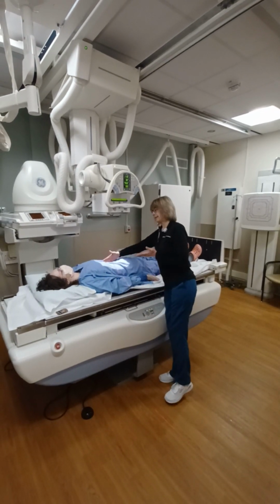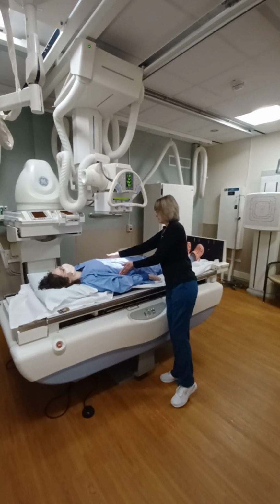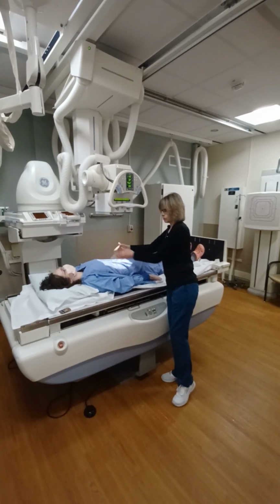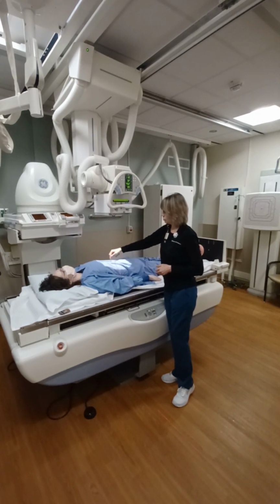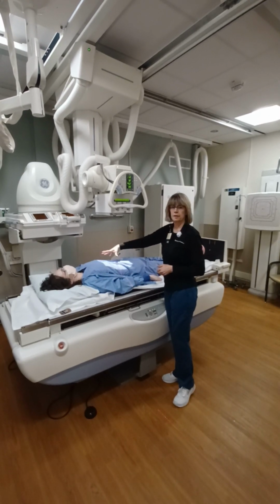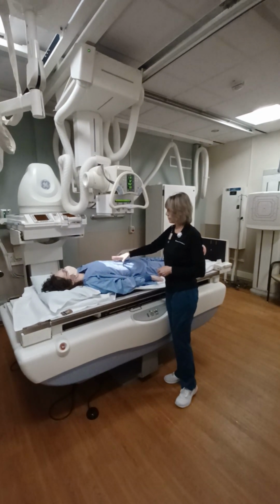I'm going to keep it at the MSP, or again, you could center slightly off to the left if you choose to do that, that's fine. Leave your collimation open to include that abdomen, especially lengthwise from top to bottom. And then this is going to give you a nice J-shaped type stomach. But you should be centered at the L1 level, again, which is where the lesser curvature of the stomach is. So you're including the GE junction, the fundus, all the way down, and including the C-sweep of the stomach.